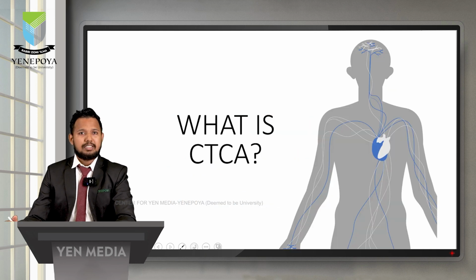So what is CT coronary angiogram? With a significant increase in the number of cardiac arrests in the current time, which is often linked to coronary artery disease, CT coronary angiogram plays a vital role in ruling out coronary obstructions, plaques or anomalies that could possibly contribute to the medical emergencies.